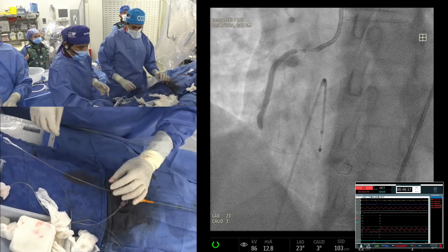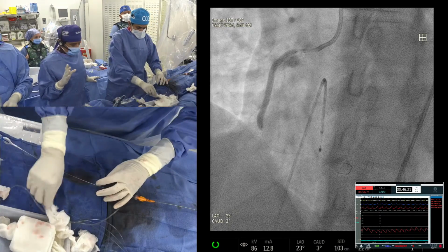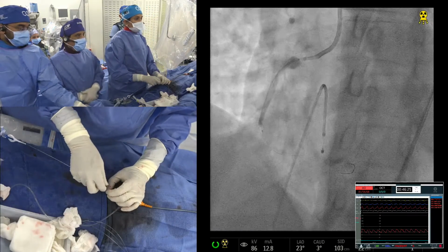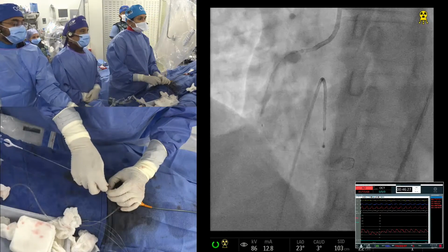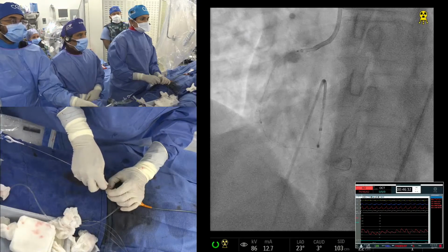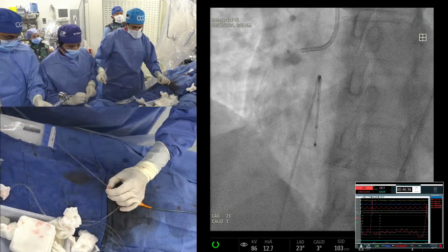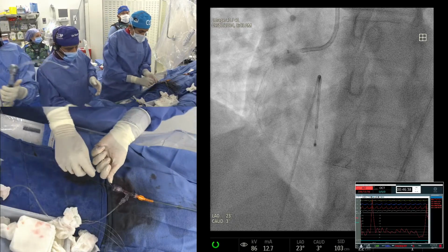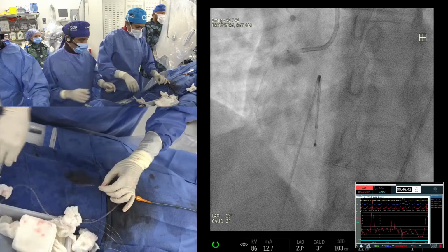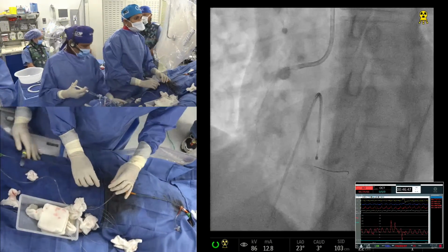As you know, by next year there will be 4 other companies coming with IVL catheters. They're working on one with lasers, and there are 2 others soon. There's a device called Fracture, and a trial will be starting, which is the laser guided IVL. Then there are other balloon-based IVL devices. So many things are coming in this IVL field, but I think we'll take until probably the end of next year to have the final results on those and any other device in the market.